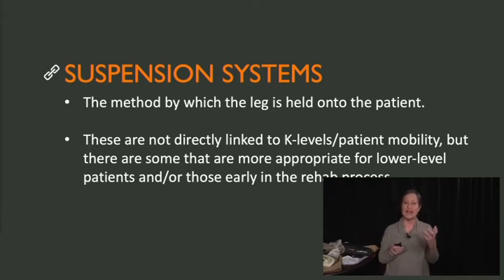That's a pretty high level suspension system, but that's something your patient doesn't get to right out of the gate either. Usually if I have a patient who goes from one suspension system to elevated vacuum, I never see them again as a therapist because they're fine. They're off walking in the community, they're back to work, they're doing everything they want to do.